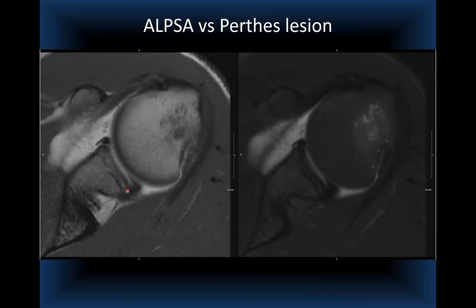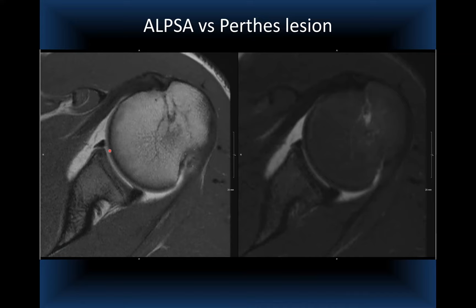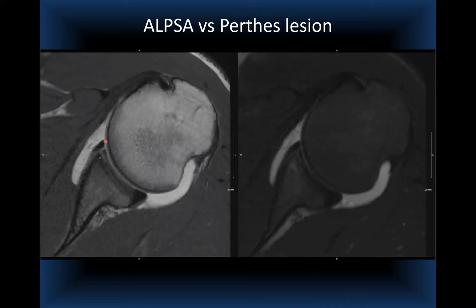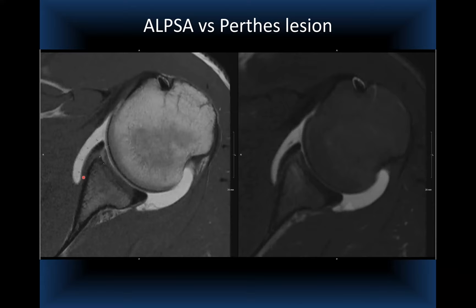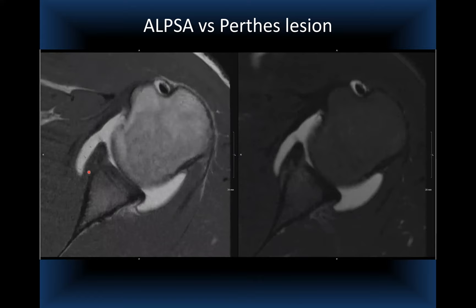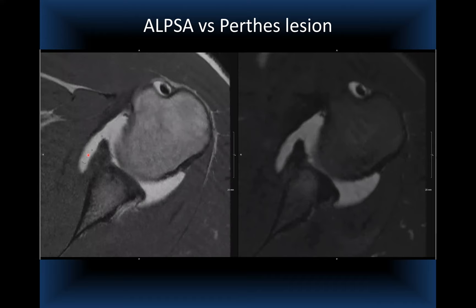For patients who cannot do ABER due to fear of dislocation, pain, or impingement, the ADDIR position (arm behind the back, adduction internal rotation) shifts contrast from the posterior to the anterior joint and allows better visualization of these lesions. A 2006 Journal of MRI article discusses ADDIR for evaluation of anteroinferior instability lesions. The patient also did ABER, revealing a posterior labral peel-back and complete anterior labral tearing extending anteroinferiorly.